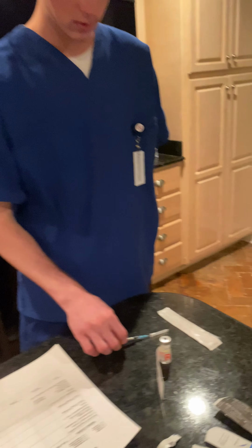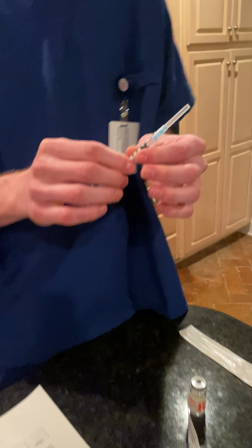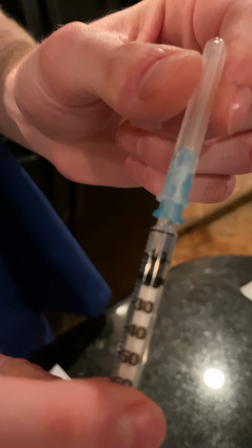I will recap the syringe. And I have 10 units of regular insulin.